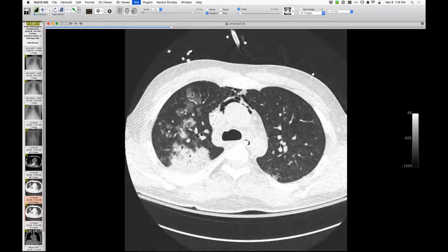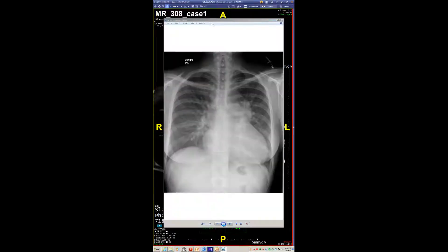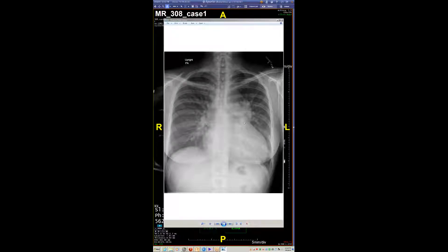I got cases. This is an interesting case — one of the cooler cases I've seen in a while. It's a young woman in her 20s with shortness of breath. If you do peds congenital heart disease and you saw this chest x-ray in a newborn or someone a couple weeks old, this is about the nicest snowman sign you'll ever see, and that's associated with supracardiac TAPVR. The issue is this is a 20-something-year-old woman, and people that age don't live for 20-something years with undiscovered TAPVR.